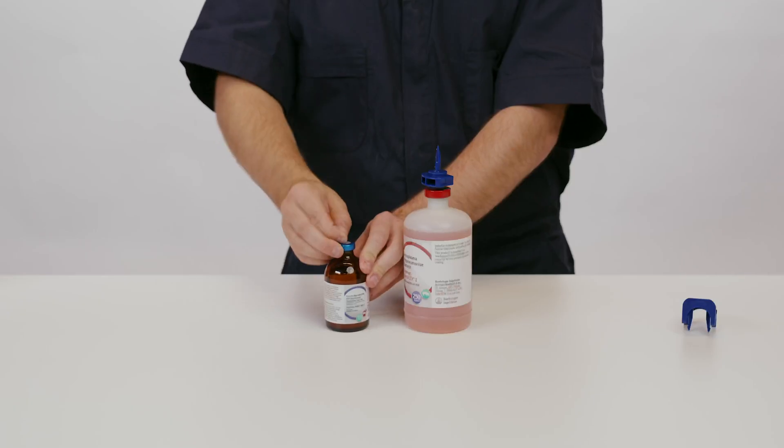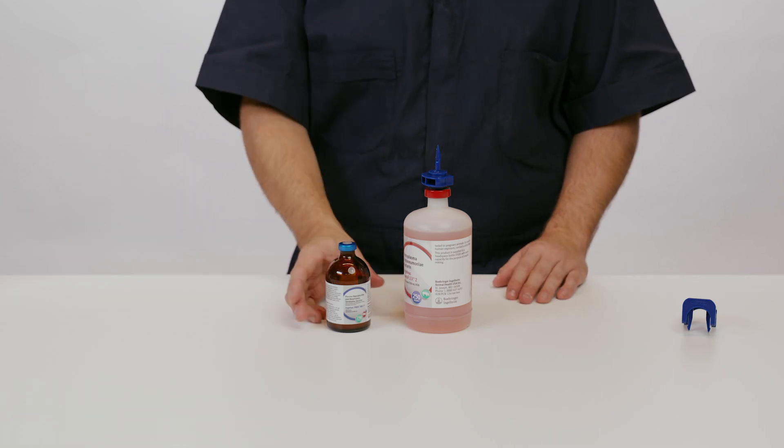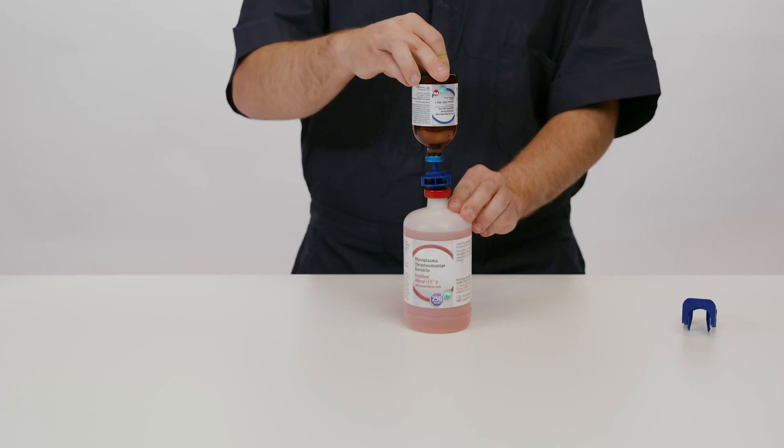Now, remove the blue tab from the Ingelvac PRRS MLV bottle to expose the rubber stopper. Invert the Ingelvac PRRS bottle over the Ingelvac MycoFLEX bottle and slowly insert the transfer spike into the Ingelvac PRRS bottle to release the vacuum.